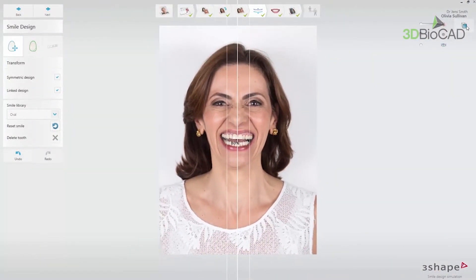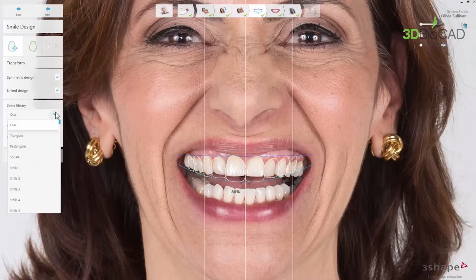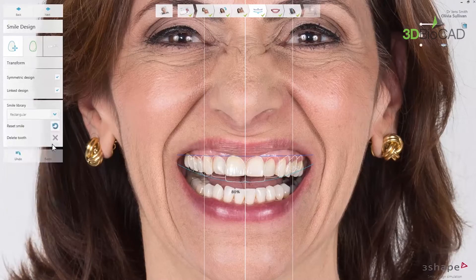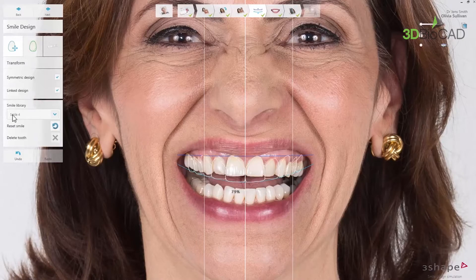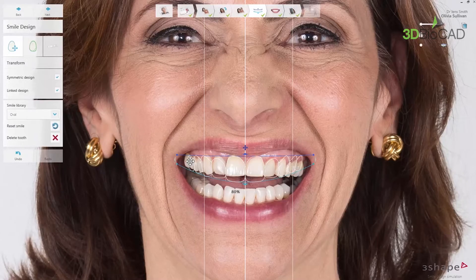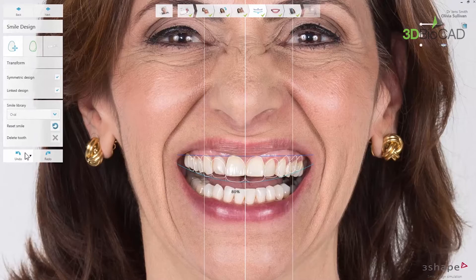While working on the outline design, you can change the default library by going to the smile library drop-down list and selecting the desired shapes. If you click twice, you can flick through the libraries using the up and down arrows on the keyboard. The default number of teeth is 10. You can remove teeth you do not wish to provide any treatment for by clicking on them. When the tooth is highlighted, you can remove it from the overlay by clicking the delete tooth button or pressing delete on your keyboard. Use the undo or redo buttons to go back, or click reset smile to return to default settings.